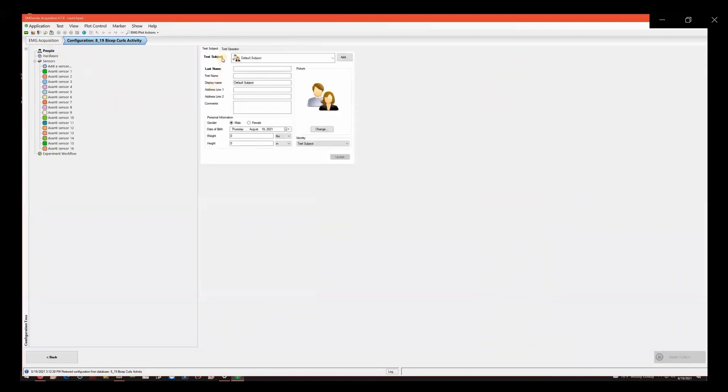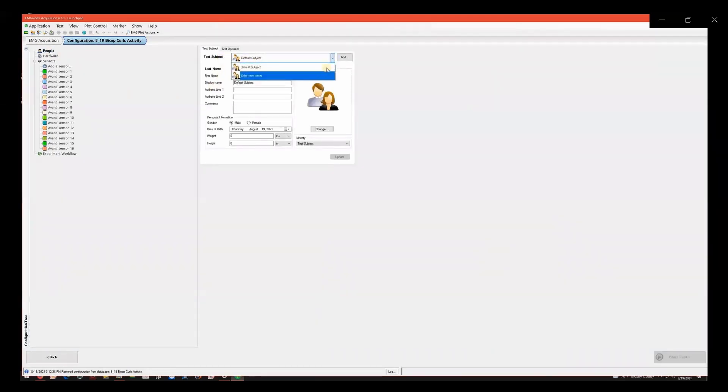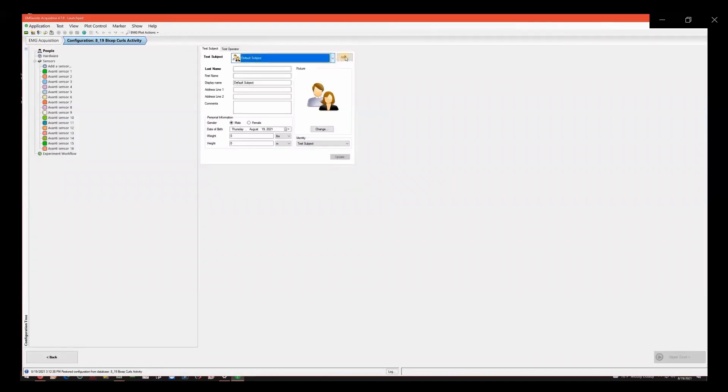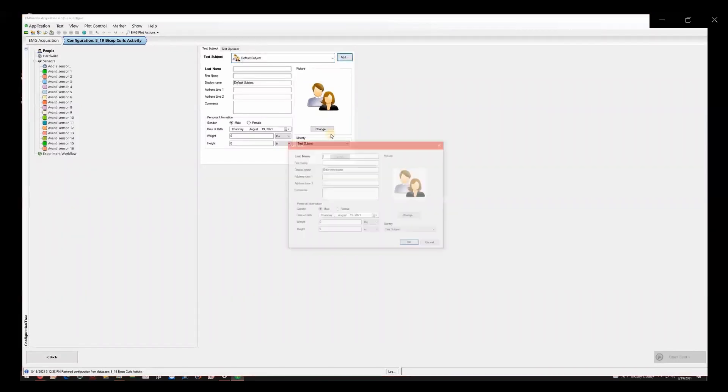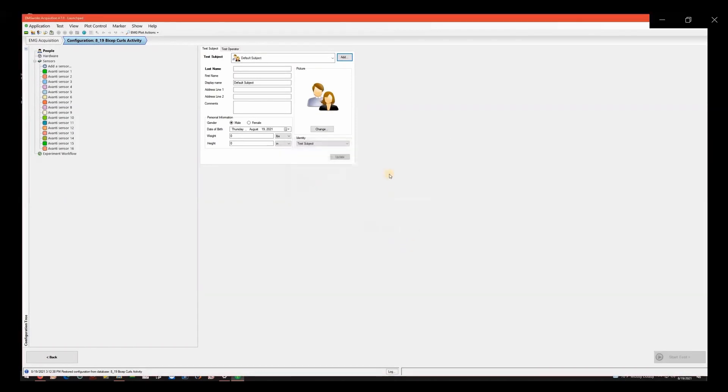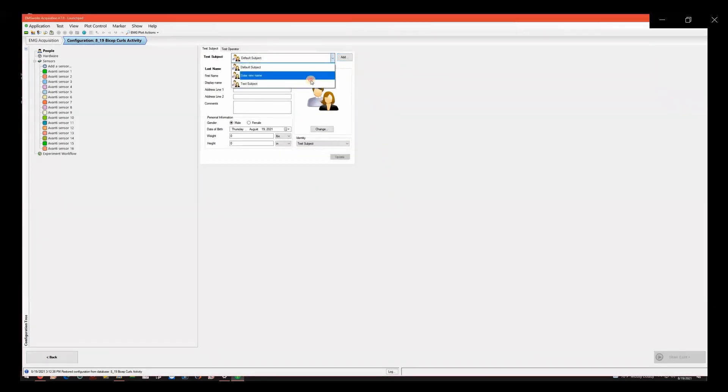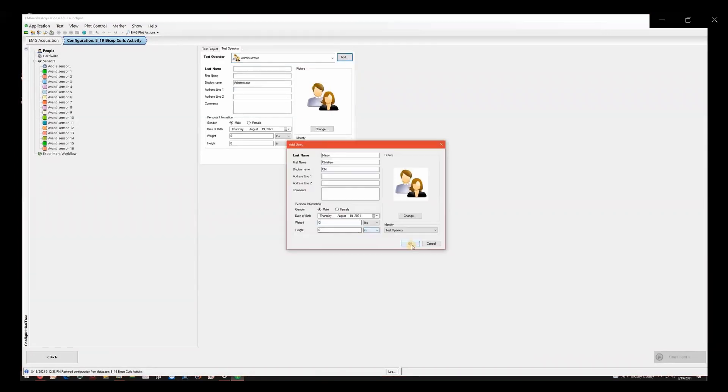Add a new entry for the test subject or select a previous subject from the drop-down list. Enter Name, Display Name, Weight, Height, and Gender. Repeat this process for the test operator. The only necessary information for the operator is name.